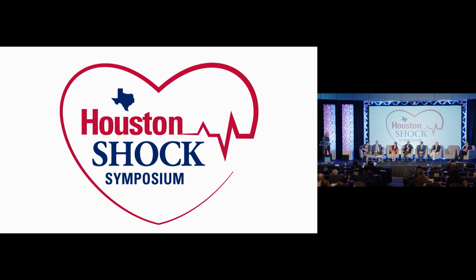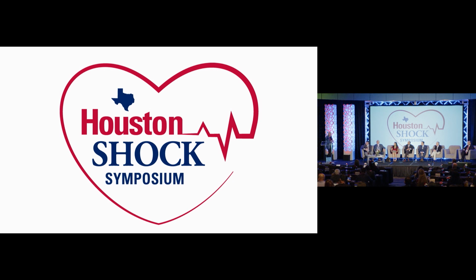That's so right. If you're really looking for LV recovery, especially when you're putting an ECMO in dire circumstances and you're wanting to recover that ventricle, you really need to unload the ventricle. Just getting the blood out just because the aortic valve opens is not enough. And I've had arguments with my chief multiple times. No, absolutely, the aortic valve is opening, so it's venting. Unloading means that the end diastolic pressure is markedly reduced, I mean, its volume is reduced and wedge pressure is reduced. Venting just means that you're taking blood out of the ventricle. Venting can, in some cases, worsen aortic valve closure. So you really have to be careful and be specific about what you're talking about.